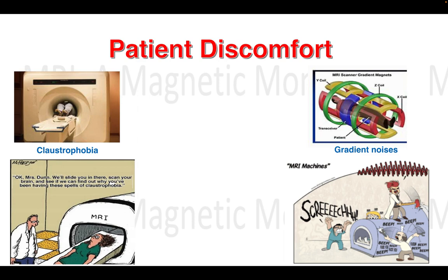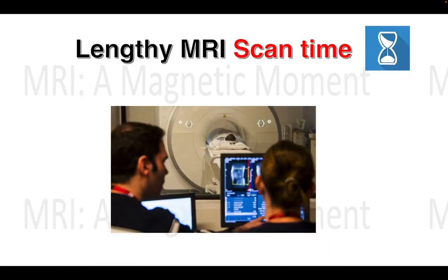So the confined configuration of the MR magnet and the loud noises are essentially some of the biggest reasons for patients being uncomfortable in the MRI environment. Among the most common complaints is the MRI scan timing.